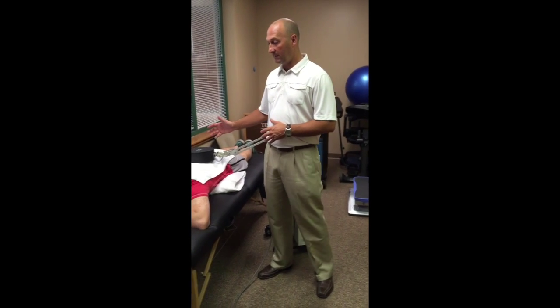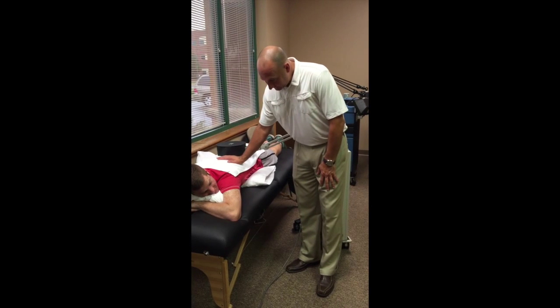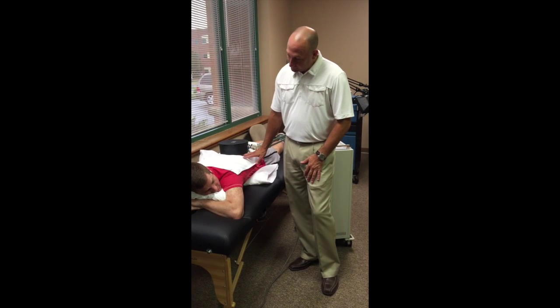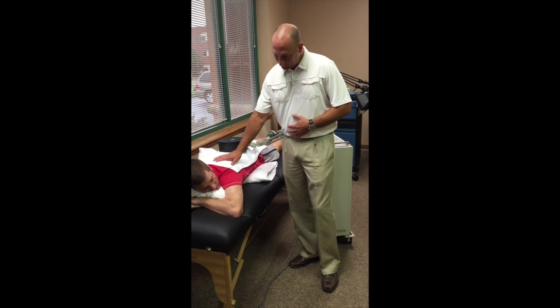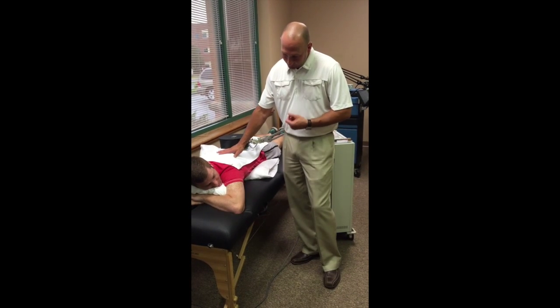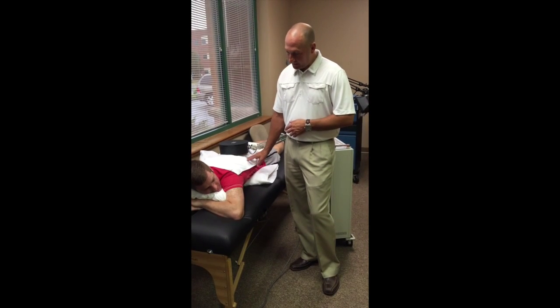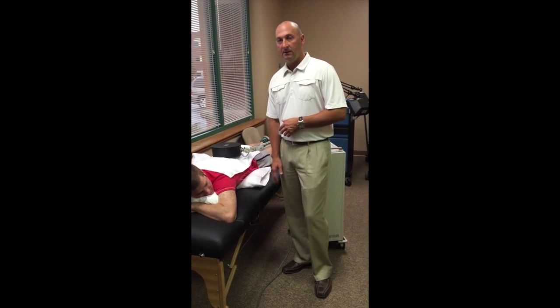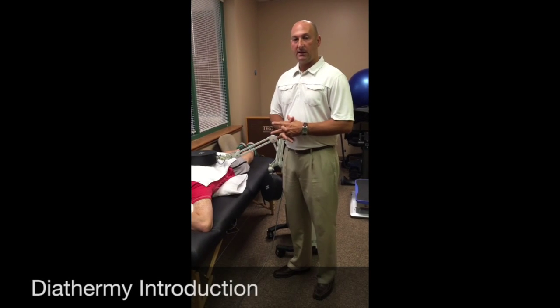So of course with shortwave diathermy, I will always go back and ask the patient, just wanted to remember and reiterate based off my notes, is there any metal anywhere in your body down through here? Nope. Okay. And do you have a pacemaker? No, I do not. Okay. And at this point, you haven't had any active cancer? Okay. And you have good sensation through your low back? Mm-hmm. Okay, very good. So again, it's never a bad thing to just reiterate any of the precautions or contraindications that you might see with an individual, and before you initiate your treatment.